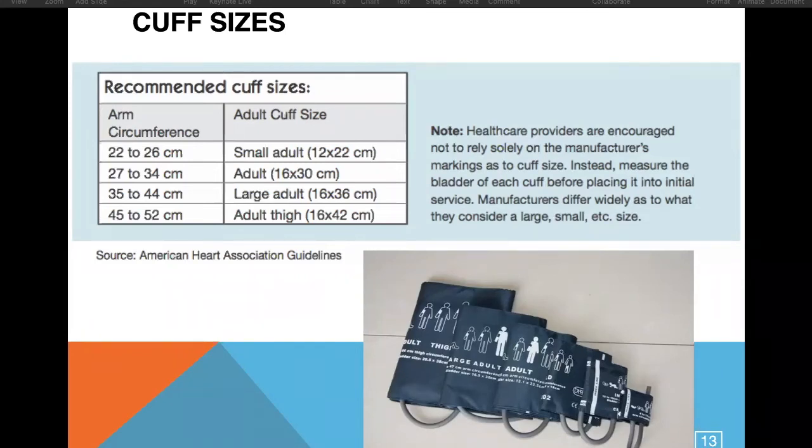And when you open them up, for the majority of them, they have a measurement rating inside. So they've got a line where the lines need to be when you place the cuff over the upper arm. Those measurement lines need to be congruent. So often you can tell right when you put it on whether it's too big or too small.